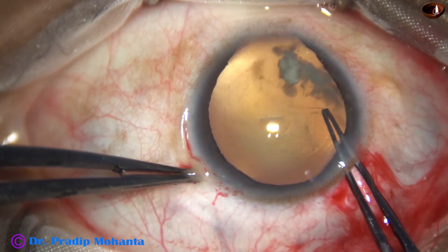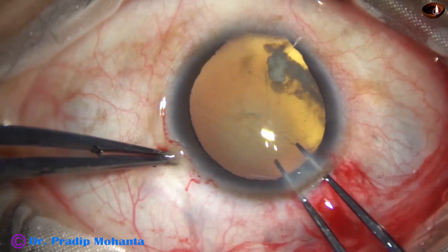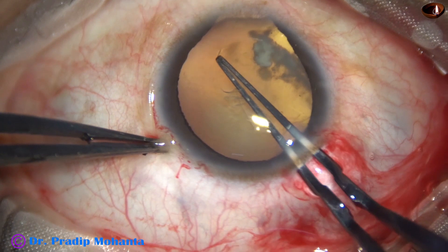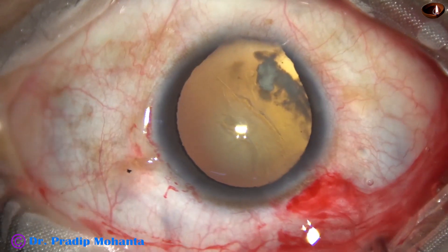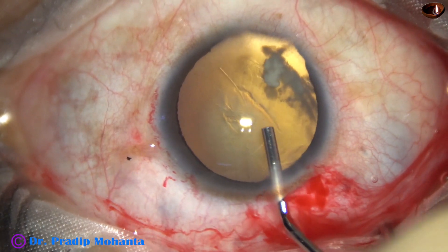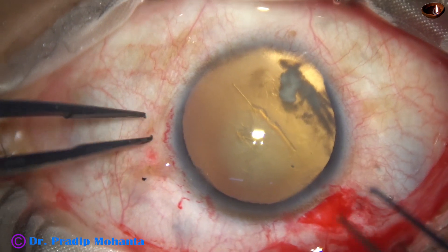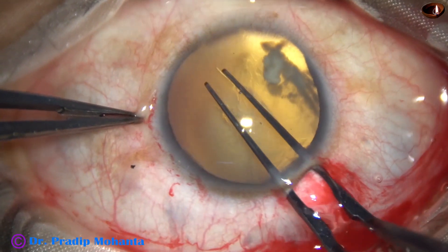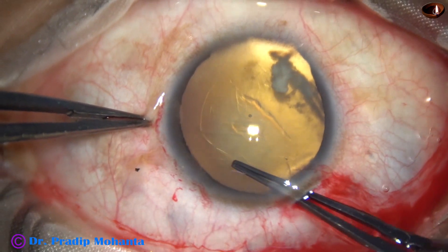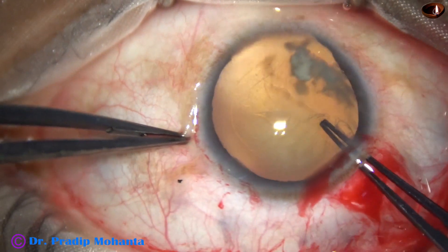Always remember that, though we lift off the anterior wall of the main wound with utrata, there is some leakage of the viscoelastic. Any time you find that the anterior chamber is getting shallow, come out and refill the anterior chamber with visco. You may have to refill the anterior chamber three or four times when you start. But whenever the anterior chamber becomes shallow, come out gently, refill the anterior chamber, and do again.